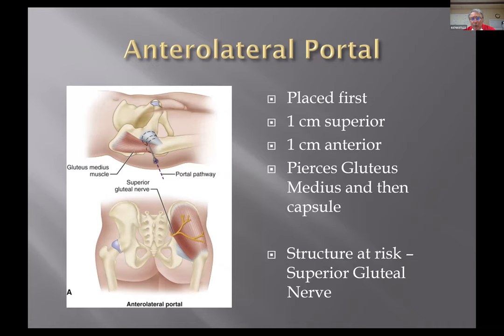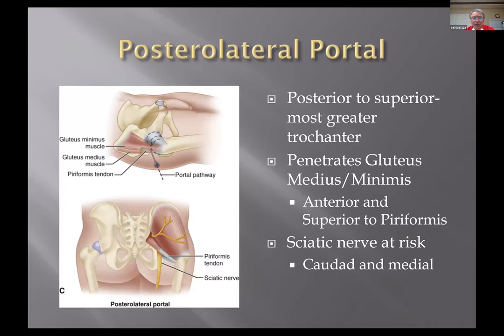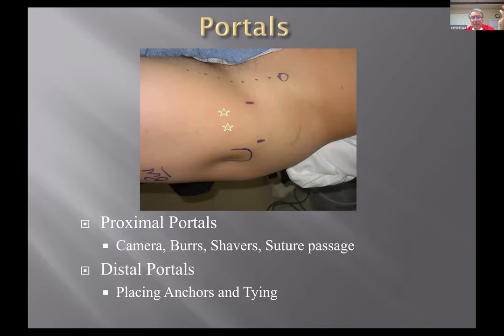Our anterolateral portal is always first. You always want to go into the joint. This is a blind portal. And your posterolateral portal is for loose bodies or for posterior structures. Fortunately, 80% of the things in hips are above the equator in the anterior part of the hip.